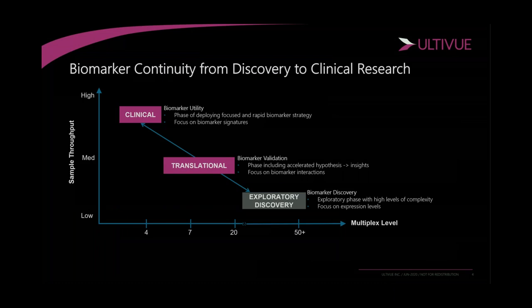So there are a lot of multiplexing platforms that are available to the community, and I'm here to say that they all have their place. All of these platforms have elegant solutions for your specific research question. And so one way to figure out what might be the best platform is based off of your sample throughput and your multiplex level. So let's do that. Right here, we're looking at three segments from exploratory discovery, translational, and clinical.